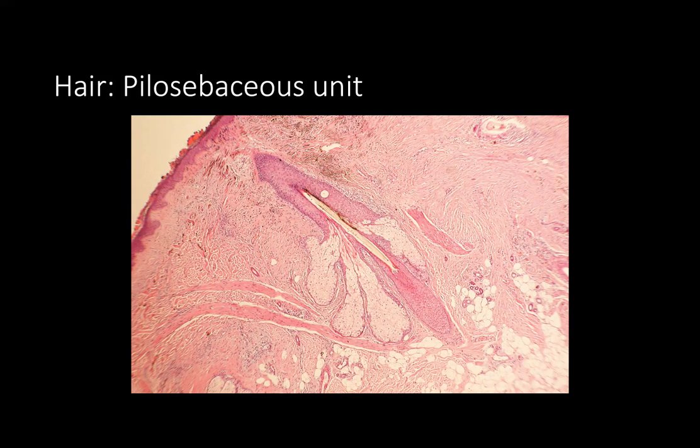And so the sebaceous glands highlight beautifully with the PRAME stain. That's been a fascinating observation that we've made as we learn more about proteins that are expressed in the skin under normal conditions as well. So PRAME has been proposed as a good marker for sebaceous carcinoma as well as melanoma. Adipophilin is your key marker for sebocytes.